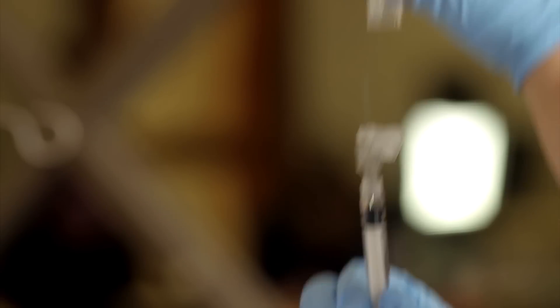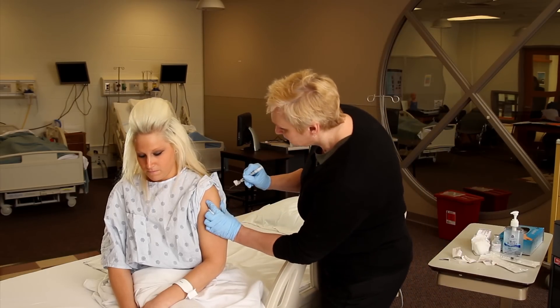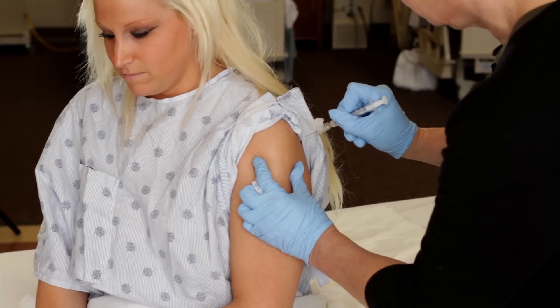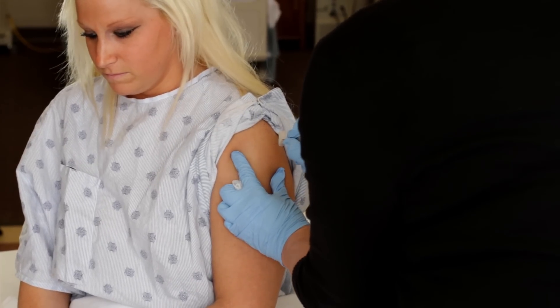Remove the needle cap by pulling it straight up. Hold the syringe in your dominant hand between thumb and forefinger. Hold the skin taut with your non-dominant hand.